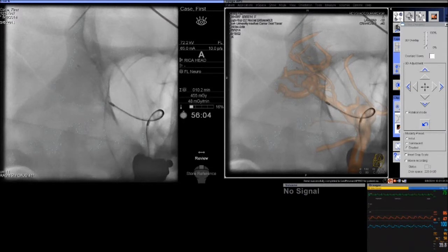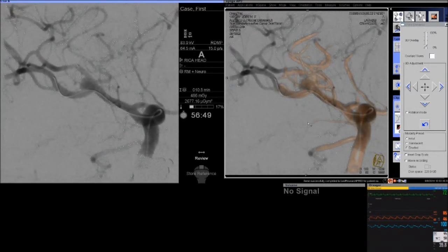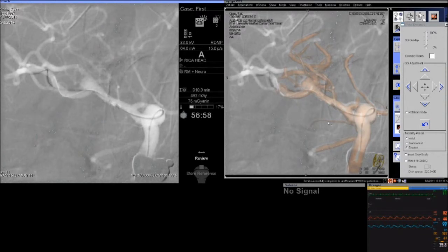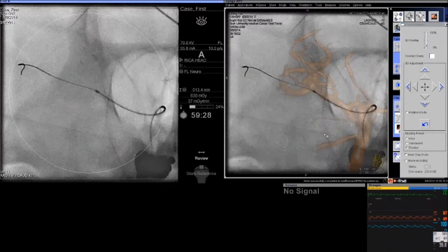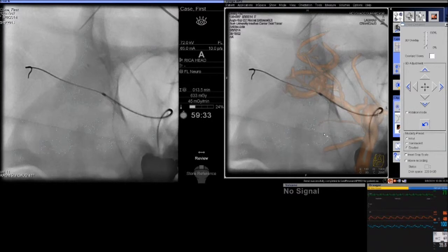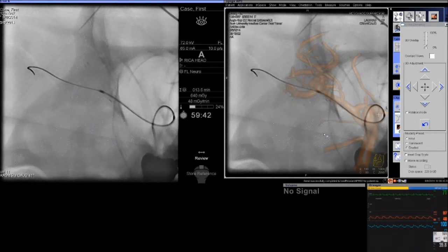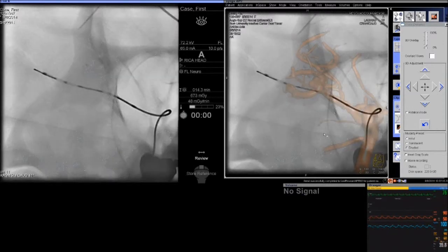Once we deploy the first stent, the microcatheter remains in position and we use the Synchro-14 wire to catheterize the second branch of the bifurcation. This is an extremely important part and must be done without moving the first device. Once we get the wire across the cells of the first stent into the M2 segment to be stented, we obtain a distal wire position to help direct the microcatheter through the stent cell. You have to magnify and watch carefully as the catheter passes through the cell — there will be a small bump — adjusting the wire and microcatheter position to find the soft spot through the stent cell without displacing the first stent.